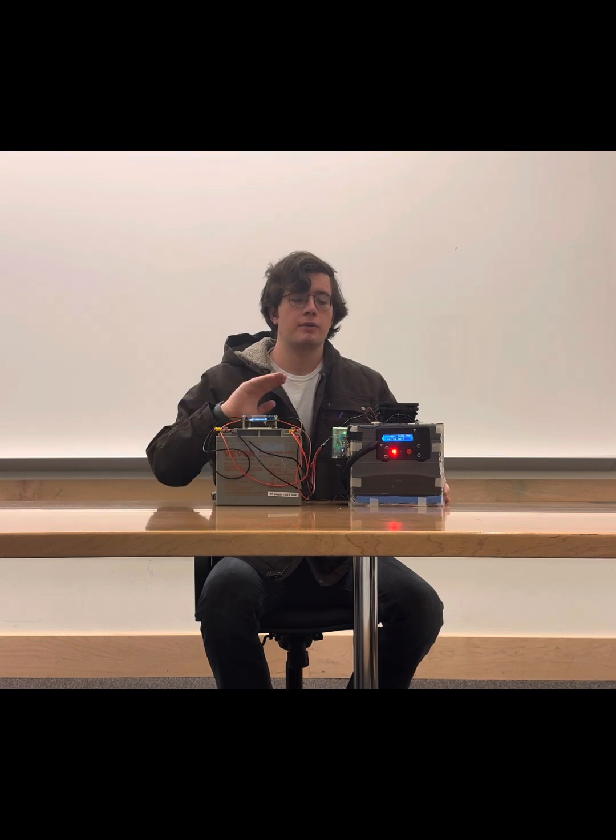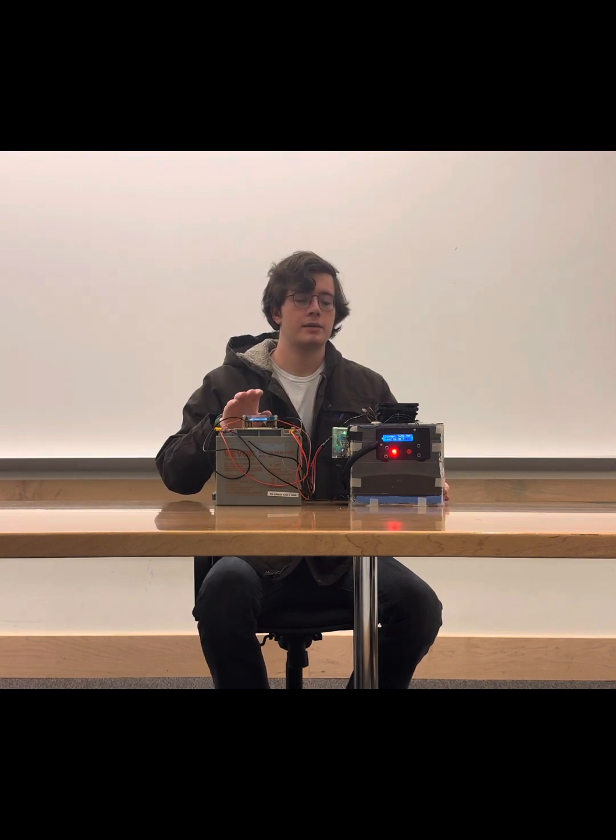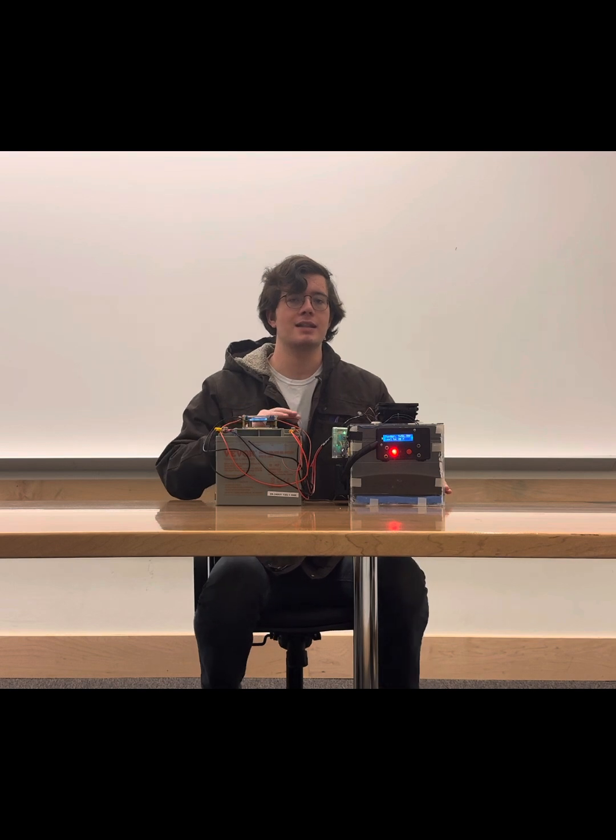The coding for our fridge is quite simple. It is a bang-bang controller that controls these 2 relays. The fans are always on. The Peltier goes on and off based on the temperature that is read out here by a thermistor within. And the code reads the temperature, sees what the difference between the temperature and the set point is, decides if it needs to turn on the Peltier, reads out warnings, and repeats that until the end of time. The buzzer is not currently on because we would not be able to hear us over it, but the buzzer is one of the warning systems. It's just not on currently.